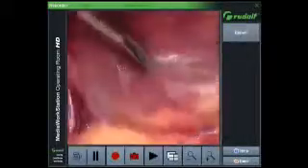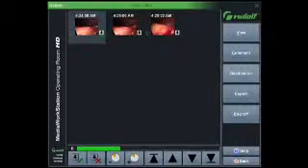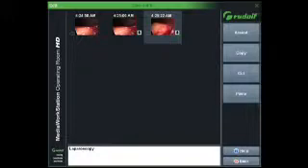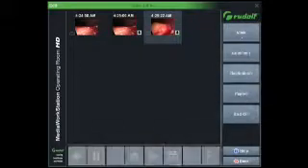After activating the Export button, you are again provided the images or video sequences taken as a summary in an image preview. Individual images are labeled by the camera and therefore differ from the not specifically labeled video sequences. By simply unselecting images that are not required, the data quantity can be limited to the absolute necessary or the export adjusted to the maximum available capacity of the external medium. Subsequent comments are also possible, as well as the selecting or reconstructing of video sequences that were made outside the individual images or video sequences taken.